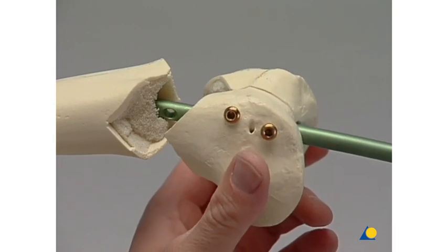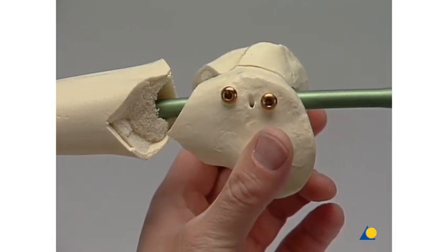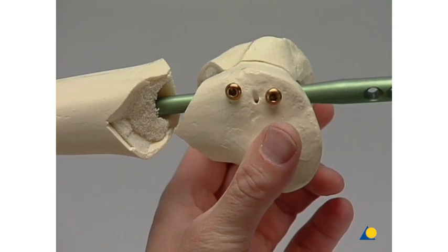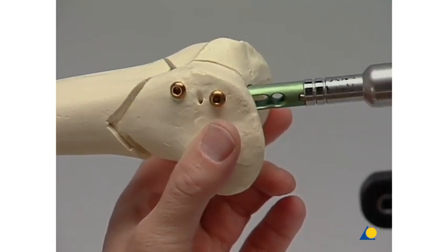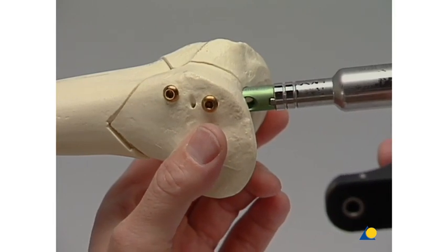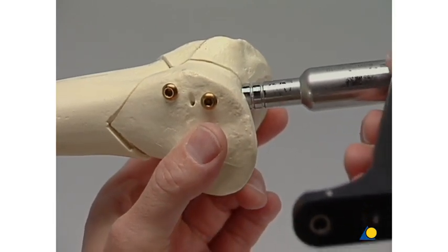In cases of complex articular fractures, drilling open the medullary canal millimeter by millimeter is recommended. When the nail is inserted, it can function as a reduction aid. The distal fragment can be threaded towards the proximal fragment.